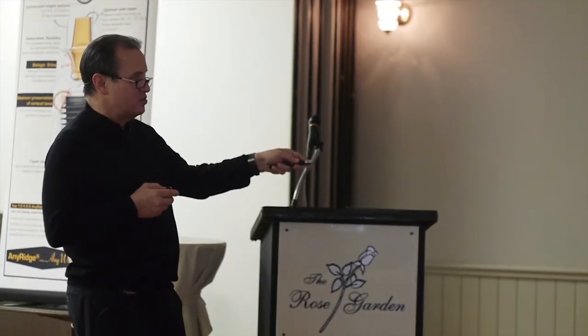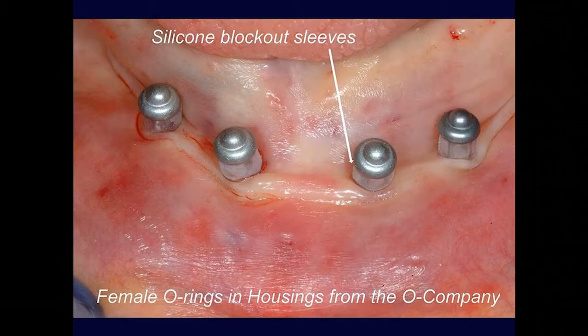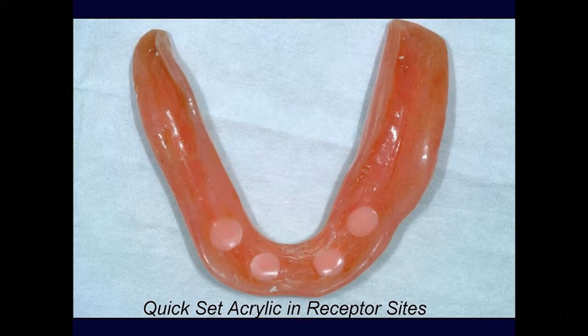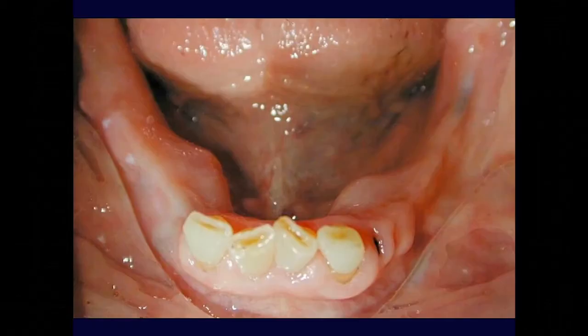These are like little silicone sleeves that you place over the shaft before you put the O-rings in so the acrylic doesn't get locked on there. And then we'll take our existing denture, check with FitCheck to make sure that this thing is seating all the way, and then go ahead and use quick set acrylic in the receptor sites to pick up those O-ring housings, and then you're pretty good. So good case. This worked out well.